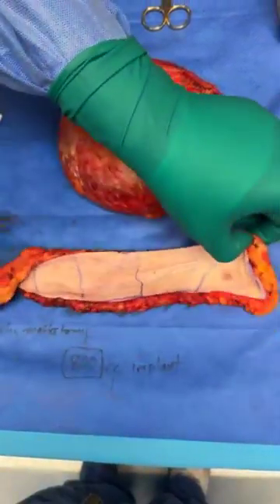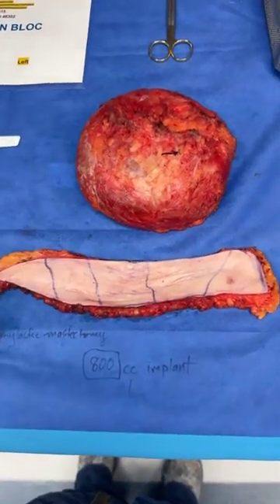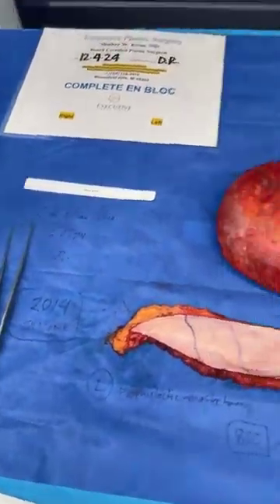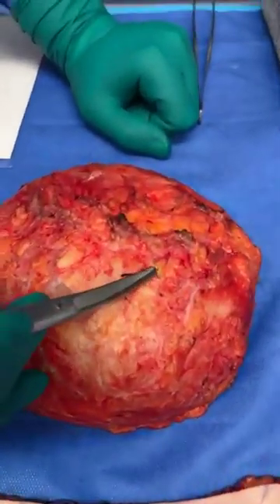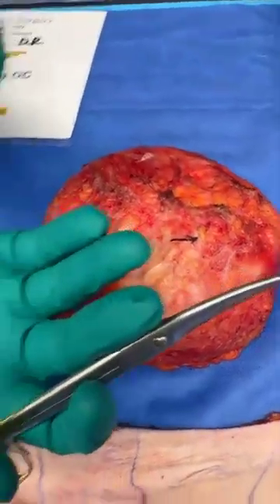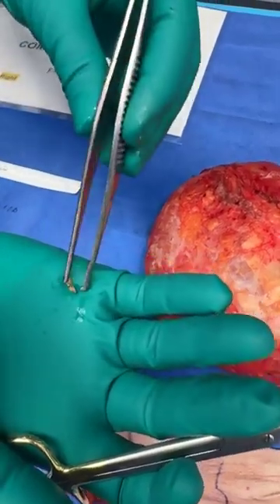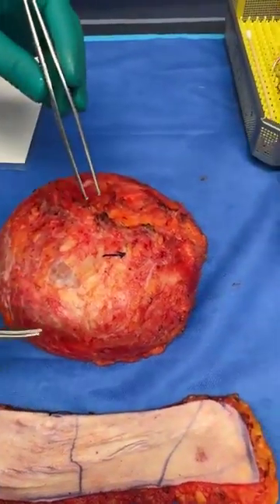And so this is the left prophylactic mastectomy 800cc implant. And if you look, this is from 2014, so just a 10-year-old reconstruction. Now, if you look at this arrow right here, here is a surgical clip. And I'm going to go ahead and remove it, and you can see right here, it's all encased. So all foreign material, including surgical clips, are removed. I'm going to give that to the patient so she knows.